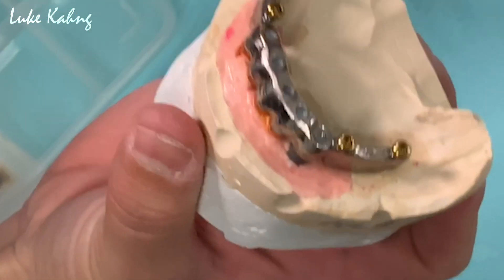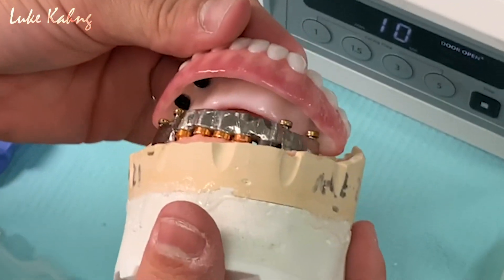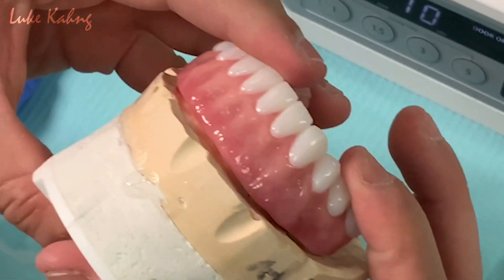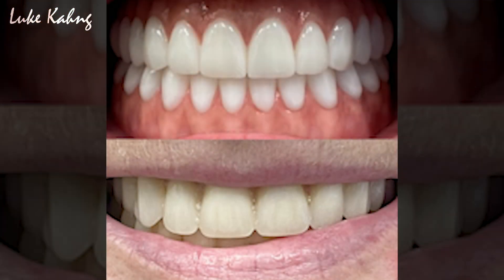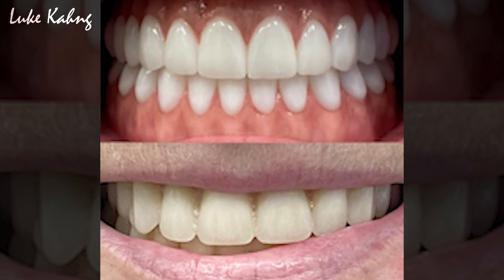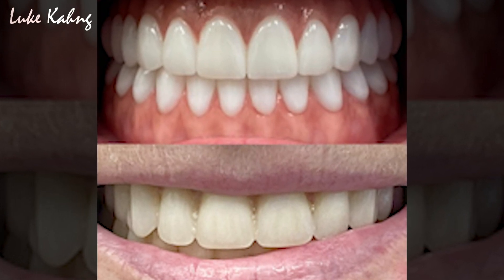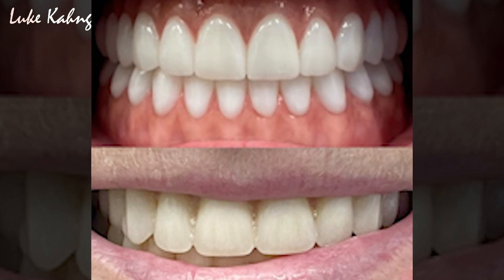If everything fits properly, then the cementing process for the Sitin 5500 zirconia locator is complete. Here's a look at the finished zirconia locator in the patient's mouth, with a comparison between the patient's previous teeth. This case was for Dr. Seth Shapiro in Florida.